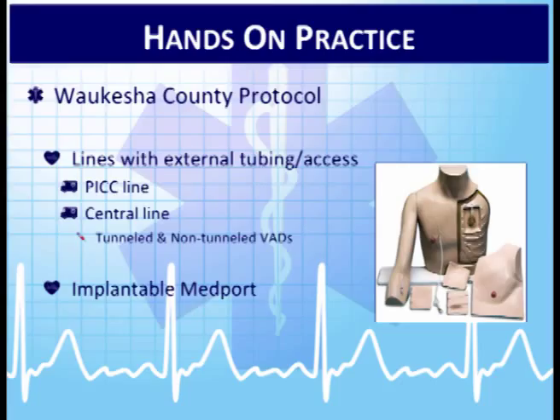Any questions? I noticed some were colored in the field, and if we're permitted to access, is there a difference? It's going to depend on if your medical director has a concrete one. In the hospital, they'll say sometimes, on the red one, we'll use that for blood draws, use the other one for infusions, or they want a certain infusion in the distal port versus the medial port.